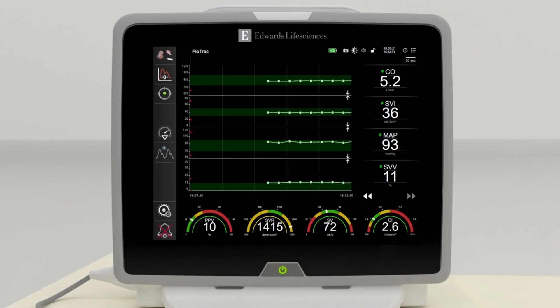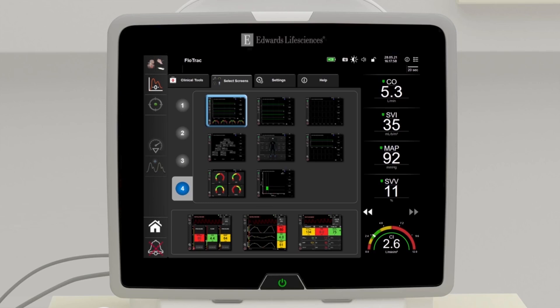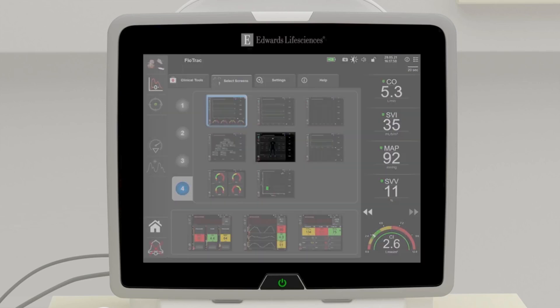Cardiac output will be displayed and will update every 20 seconds thereafter. View screens such as the graphical trend screen, animated physiology screen, and cockpit screen.